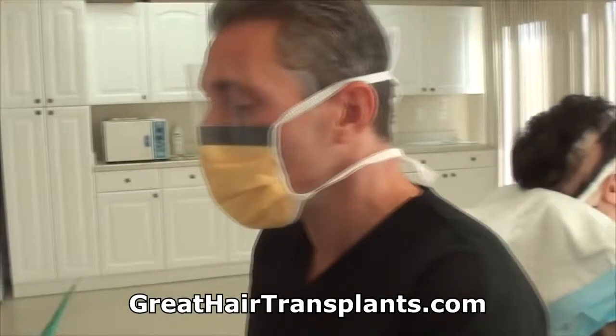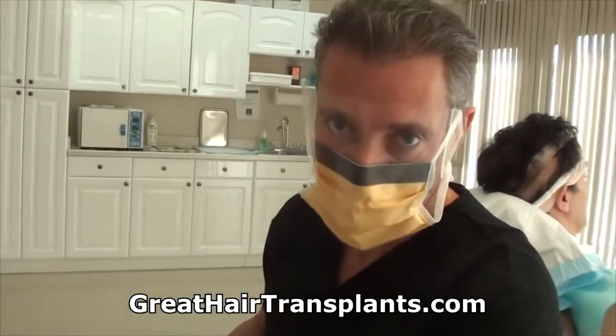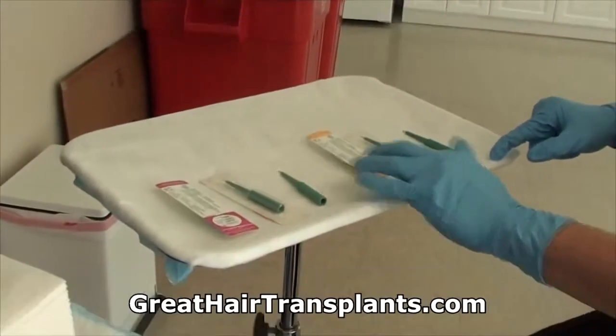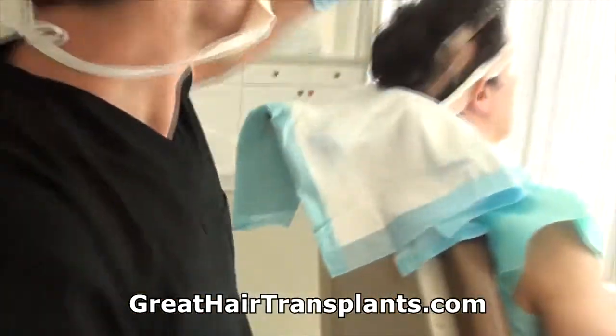So what we're going to do is show you the different methods that are being done today, and we're going to show you why these methods make zero sense as far as the final outcome. Okay, so I'm going to use a 1.5 millimeter punch just to show you the process. I'm going to go bigger than what the doctors do. This is a 1.5 millimeter punch, and we're now going to take a follicular unit extraction out.